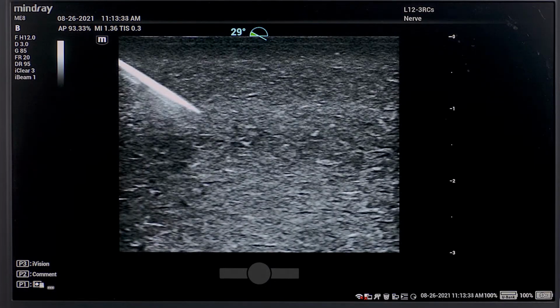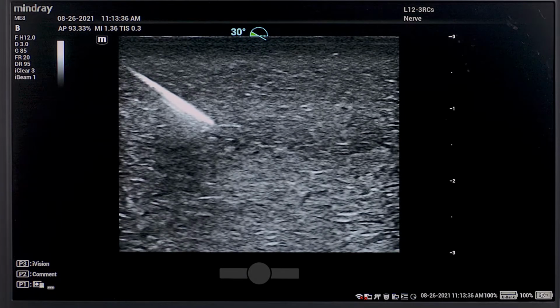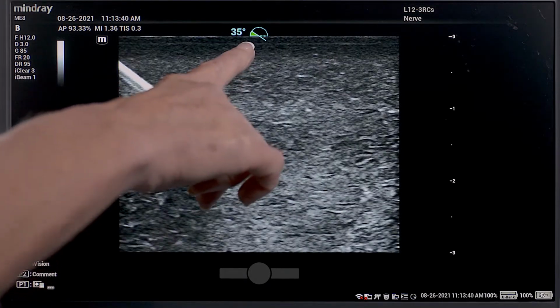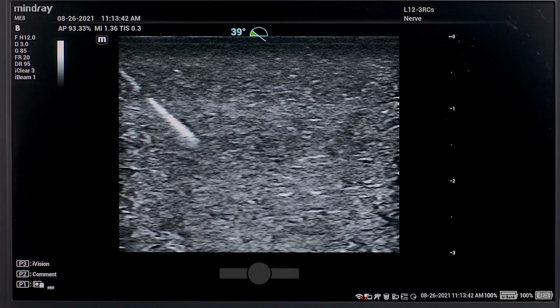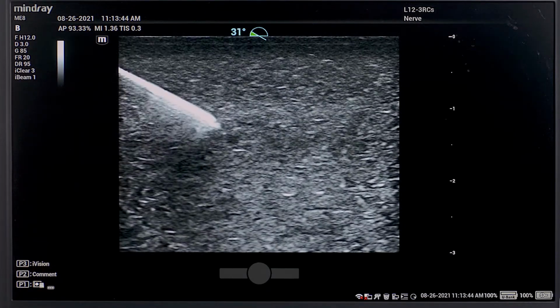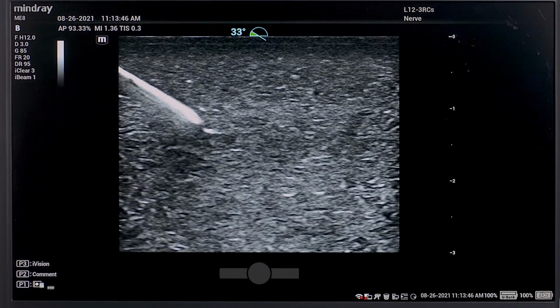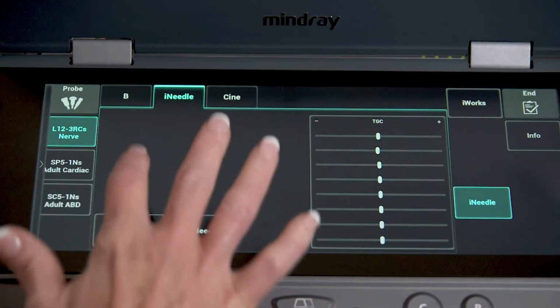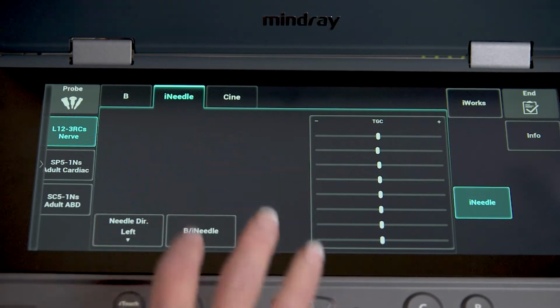The system electronically steers the ultrasound beam towards the perpendicular interface of the needle, thus enhancing the needle appearance. Notice the degree of inclination automatically adjusts to the degree of the needle trajectory. iNeedle controls can be adjusted on the touch panel under the iNeedle tab.